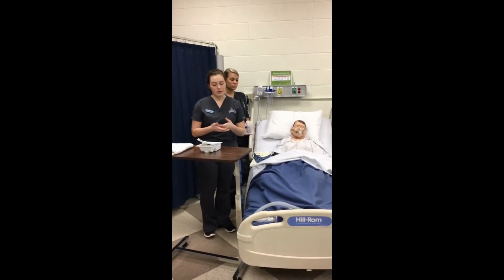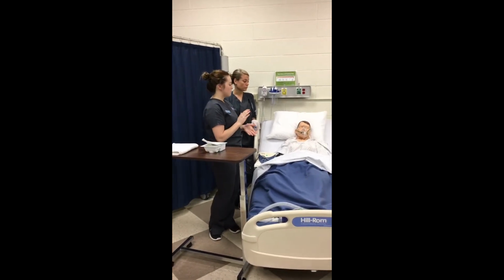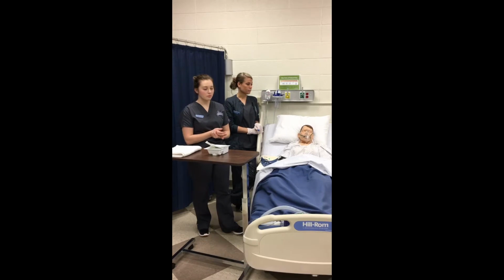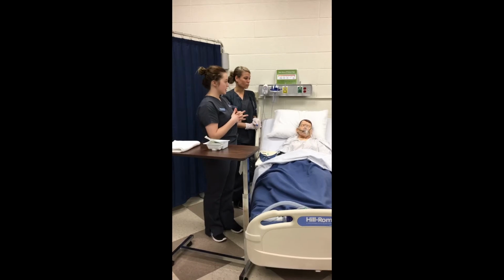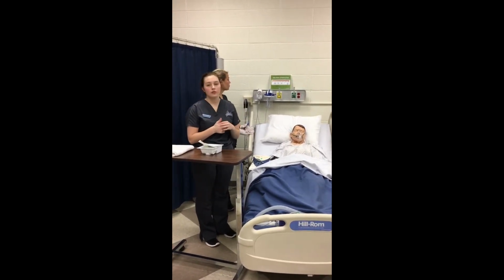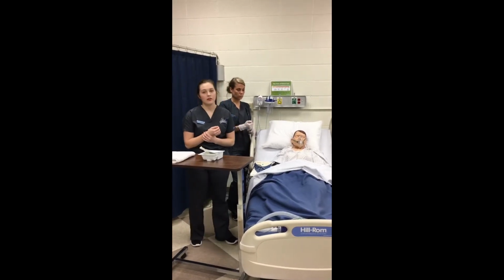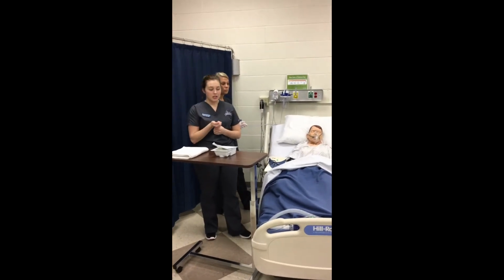Next, you're going to want to assemble your equipment, which I have done, and then go into your patient's room, identify yourself to the patient, identify the patient with 2 patient identifiers, and explain to them the procedure and why it is necessary. After that, I am going to make sure that my wall suctioning is on and at 80 to 120 millimeters of mercury, and at this time I'll put on a clean glove, test my suctioning to make sure there are no malfunctions. I'll remove my glove to perform hand hygiene and provide privacy for my patient.